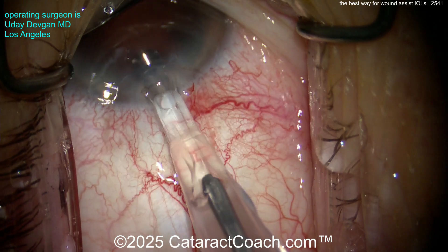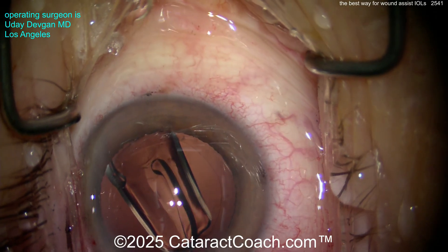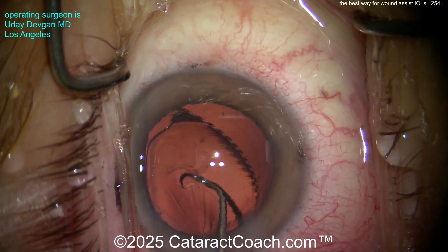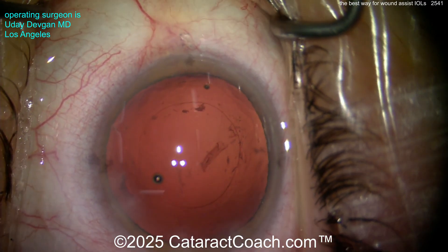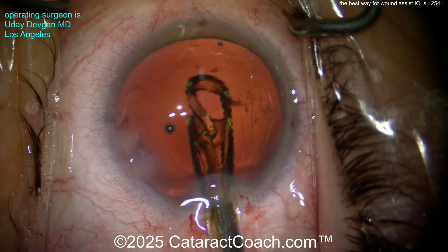As the eye goes into the nasal canthus, you lose the view. Now watch me insert the lens here — notice how initially the eye moves out of primary, but then we get the eye back in primary, and that's okay. Now this is a toric lens. I'm going to show you some toric lenses because those require two hands on the injector — one hand to hold the tip, the other to deliver it with the plunger or the screw.